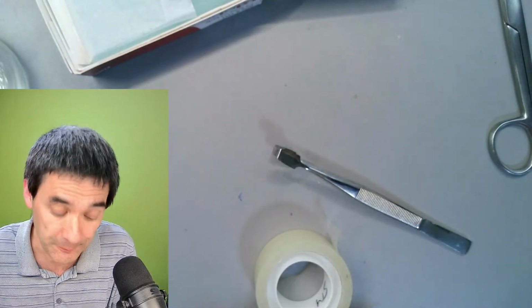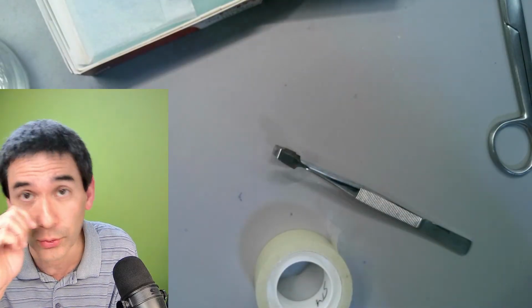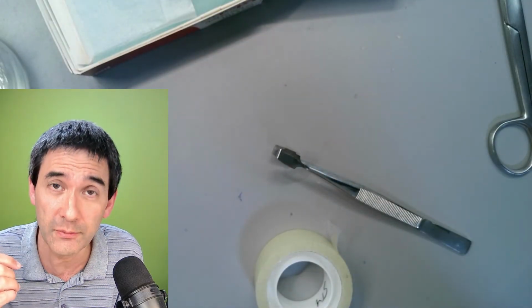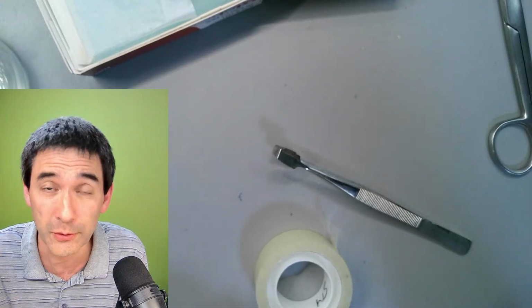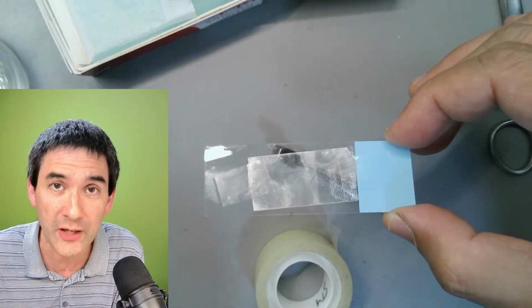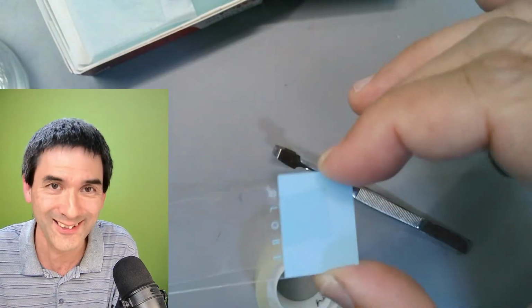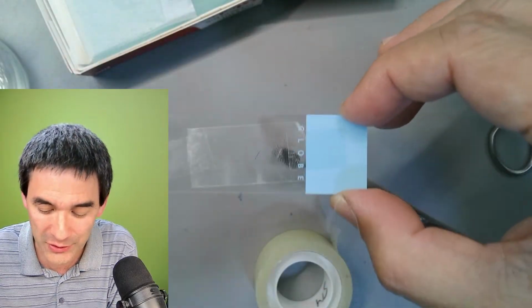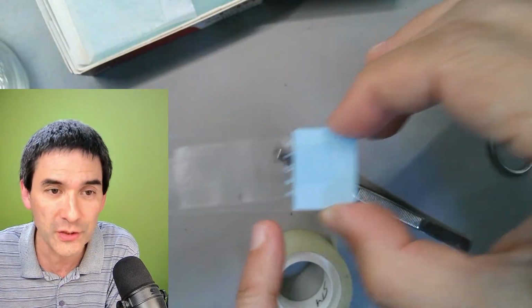Okay. So what I'm gonna do is I'm gonna show you what I have done, and because most likely you need a mirror to do it properly, and most likely I'm not gonna be able to find face mites now, because it does take a little bit of trial and error. For this reason, I've prepared 2 slides here which actually do contain a face mite each, because I checked. Okay, so in case I'm not able to extract any face mites now or find any now, we're going to be using those slides here.